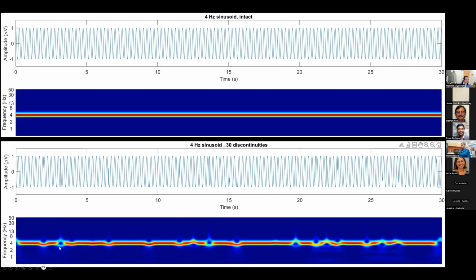What's so interesting to me is that sometimes, depending on how this discontinuity is defined, you completely lose the power at all. This is pretty interesting to observe. Standard filter functions, let's say in EEGLAB, are designed so that they do not go over this discontinuity. Every time a discontinuity is detected, the filter stops before the right edge touches it, and resumes the process from the left edge touching that discontinuity, so that this discontinuity is not included in the final result.